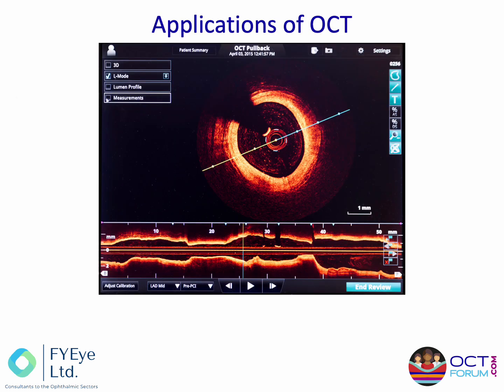It's also important to remember that OCT is not purely an ophthalmic product. It is widely used in many more medical and non-medical arenas. The example shown here is a scan of a blood vessel allowing better understanding of conditions like aneurysms and clots, for example. And this is not OCTA, this is actually inside a blood vessel.